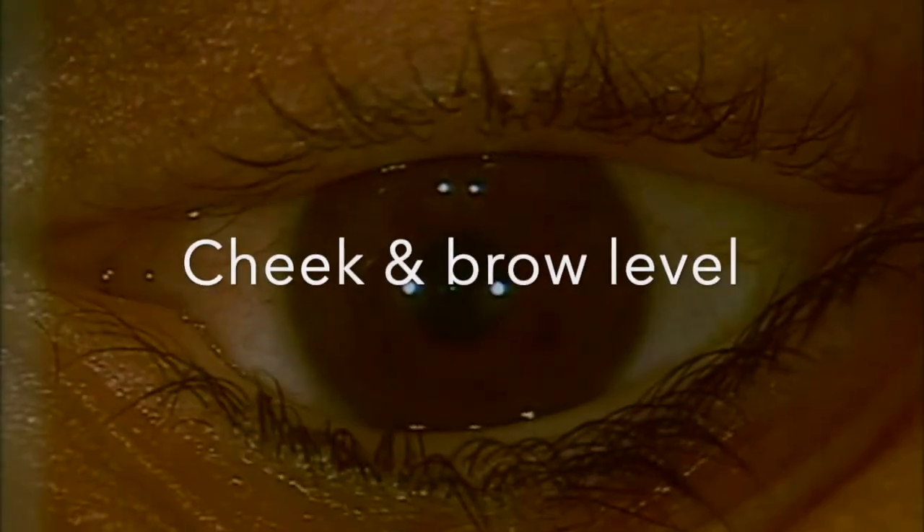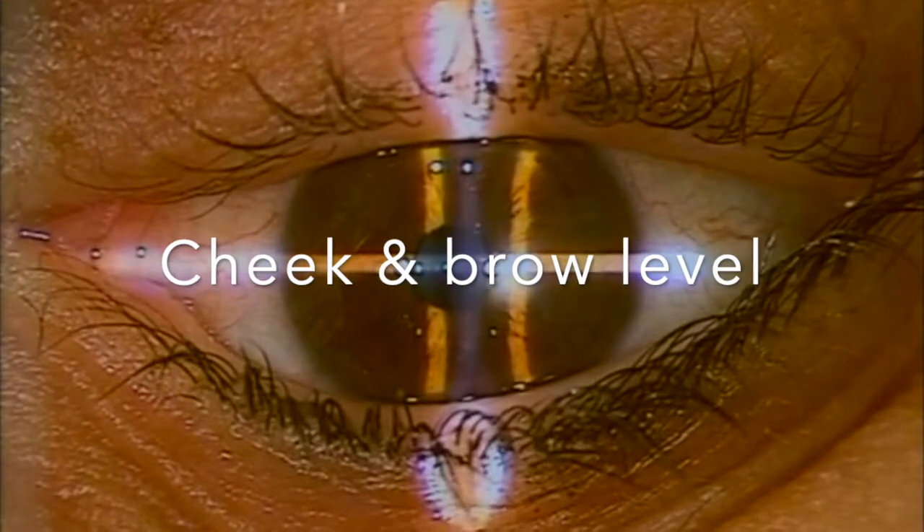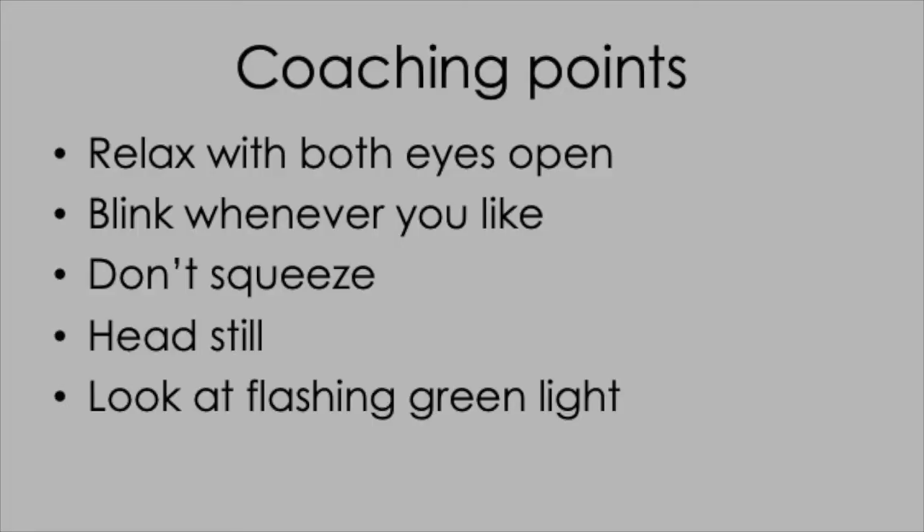Firstly, operate with low light levels in any form of laser vision correction — this helps the patient to maintain fixation comfortably. Secondly, make sure you've got a good head position with the cheek and the brow level to make sure that the eye is right in the middle of the palpebral fissure all the way through the surgery. Before you start, always rehearse a few coaching points: relaxing with both eyes open, blinking whenever they like but not squeezing, keeping the head reasonably still and making sure they always look at the green fixation light.